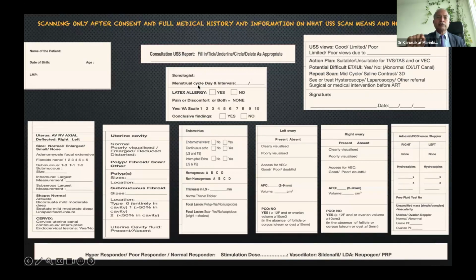So ultrasound findings should be linked to the stage of the menstrual cycle, because cyclical changes need to be documented. Today itself, I received a second opinion call after an ectopic management of a letrozole-induced ovulation induction timed intercourse case. She received methotrexate and beta-hCG came down. Because she was having irregular spotting here and there, I did ask her to get assessment, but I was told for her to take Duphaston. And her endometrial thickness is 4 millimeter. And this is from an IVF clinic.